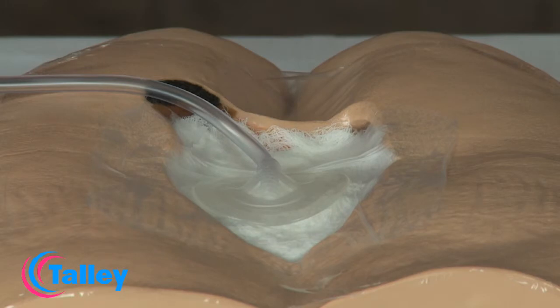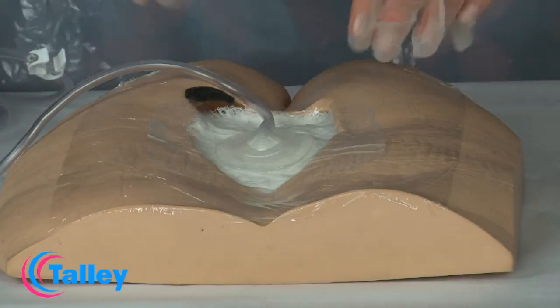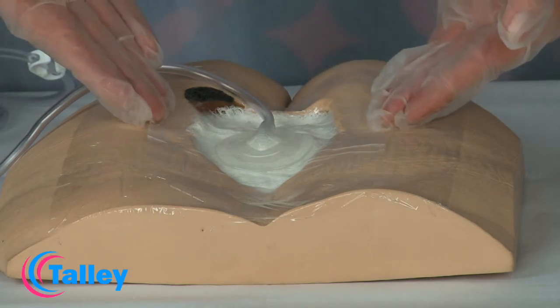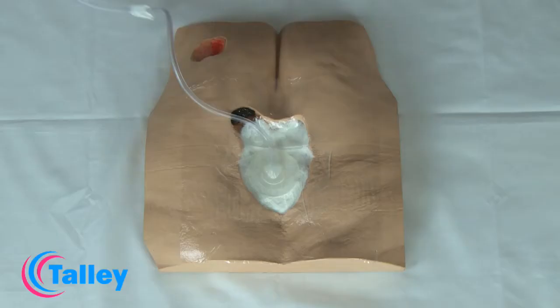The dressing integrity should be checked every 2 to 3 hours and at every shift change, and these checks should be documented in the patient's notes. Depending on the patient's status and your clinical judgement, the initial dressing change should take place after 48 hours and then every 48 to 72 hours thereafter. For infected wounds, the dressing may need to be changed initially every 24 hours.